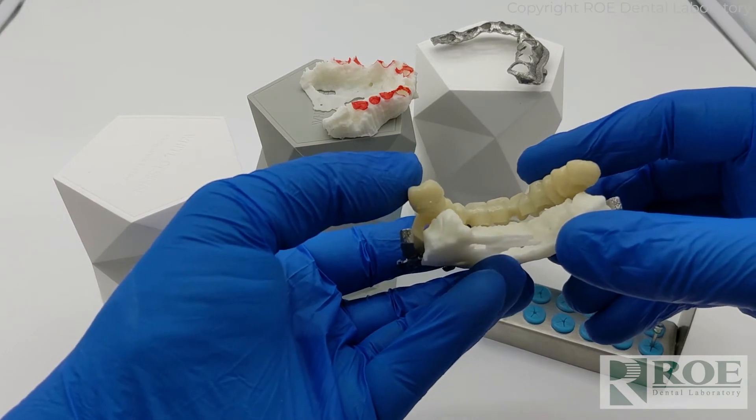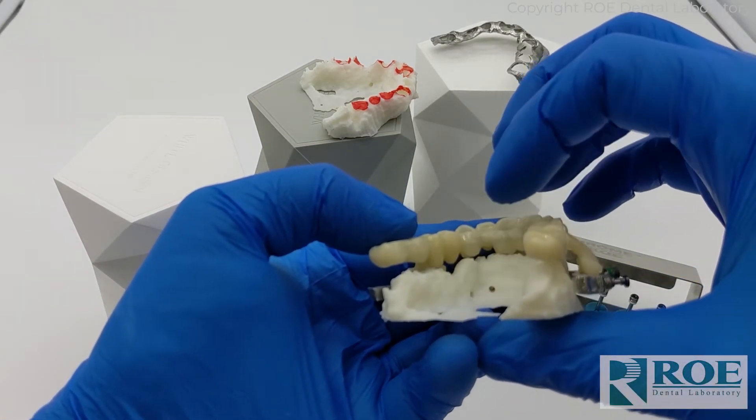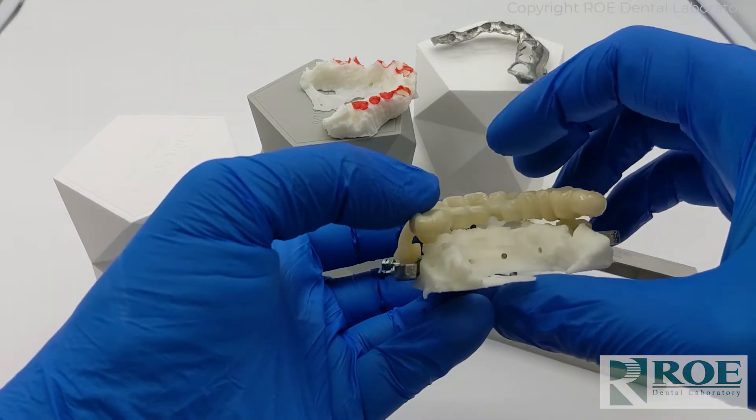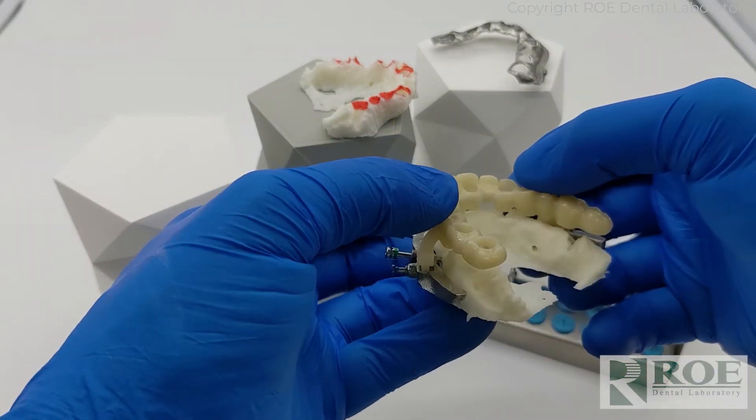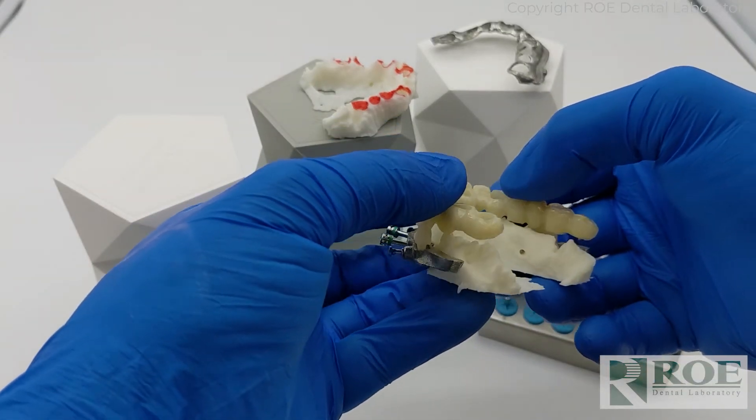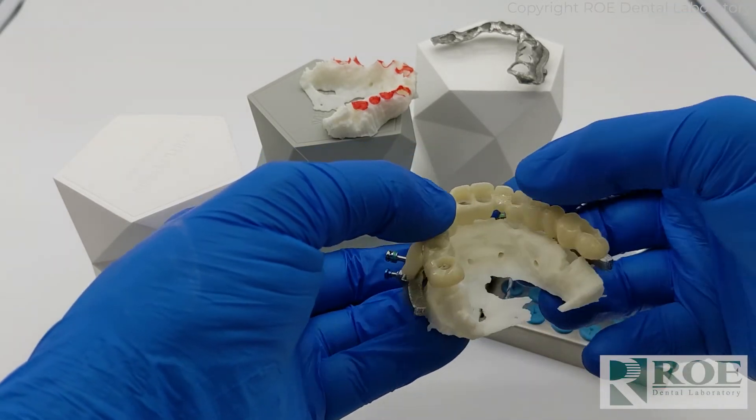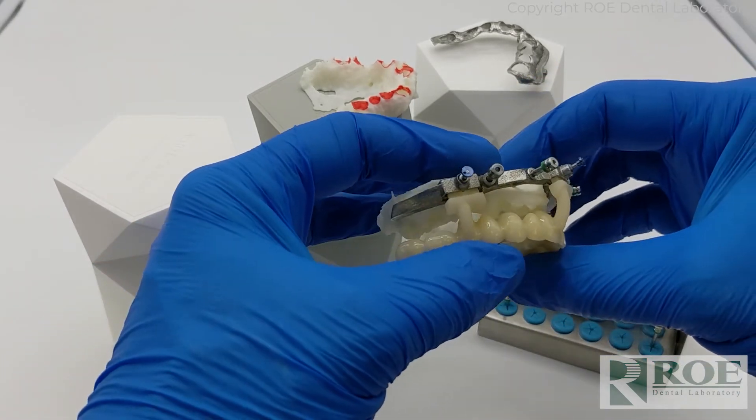You'll see here underneath pontic needs adjusted right at that site under number nine and then a little bit under 12, 13. You can see those were the sites we also adjusted. When you're in the mouth during surgery, you will notice where it's not passive and that's where to adjust it.